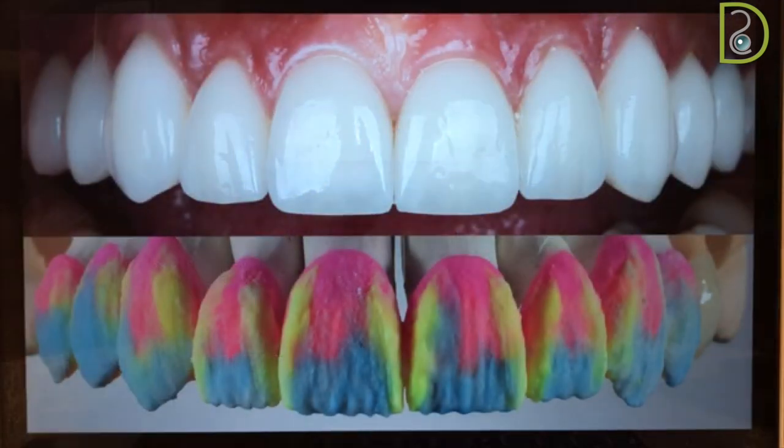Now, the case has arrived. The first thing to do is check it on the cast itself. Make sure that all margins are fine and you're happy with the proximal contacts, and later on you start to place it and try it in the patient's mouth.